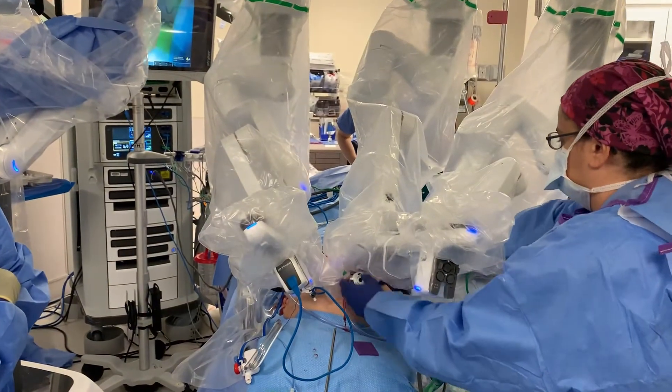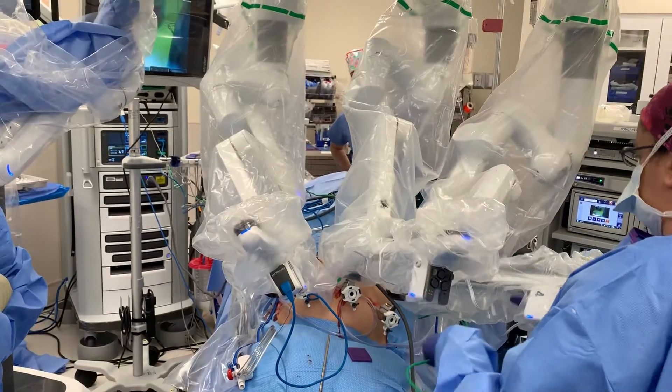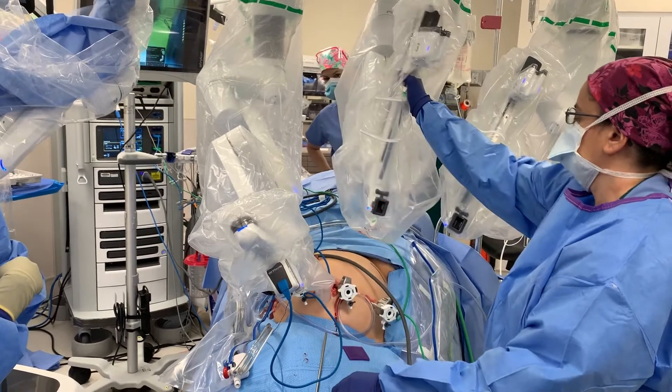I'm telling my tech to essentially undock the two left arms and simply, as you can see, just stow them up and push them off.